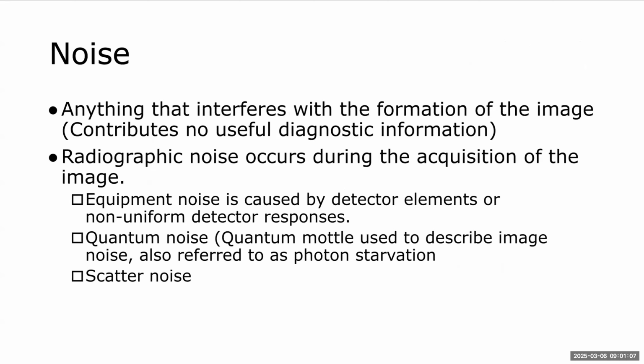Noise is anything that interferes with the formation of the image. It contributes no useful diagnostic information.